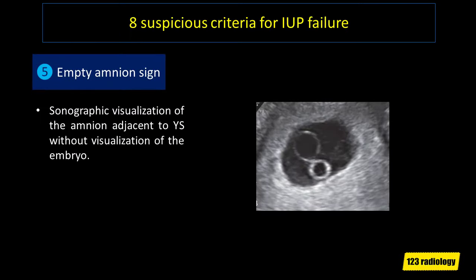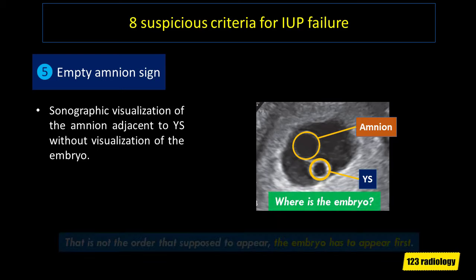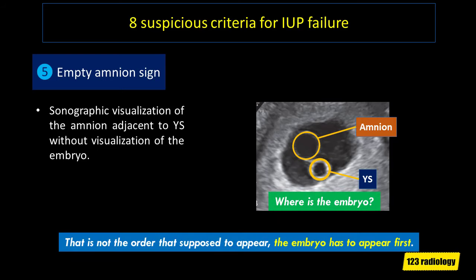The fifth suspicious criterion is the empty amnion sign: sonographic visualization of the amnion adjacent to the yolk sac with no visible embryo. As you can see on this image, here is the yolk sac and here is the amnion — but where is the embryo? That is not the order that is supposed to appear; the embryo has to appear first. This is suspicious for pregnancy failure and follow-up ultrasound study is recommended.